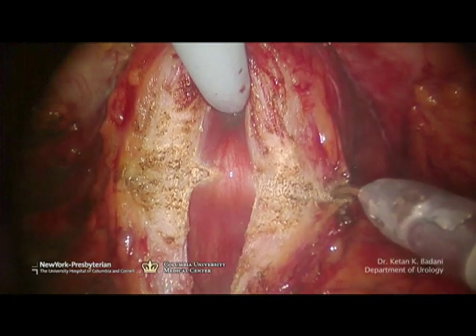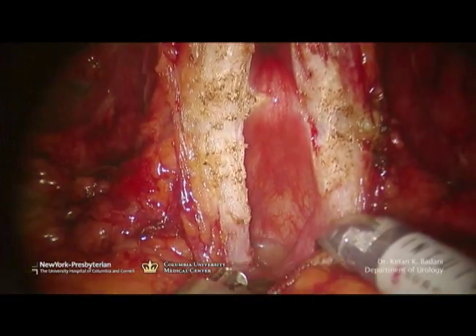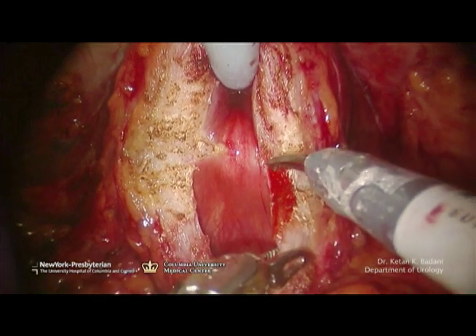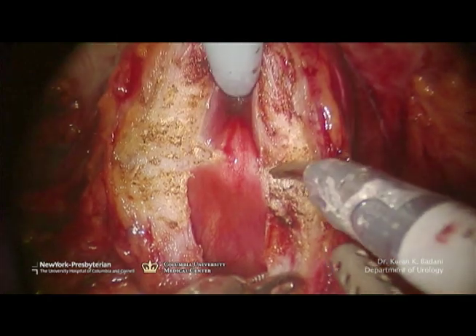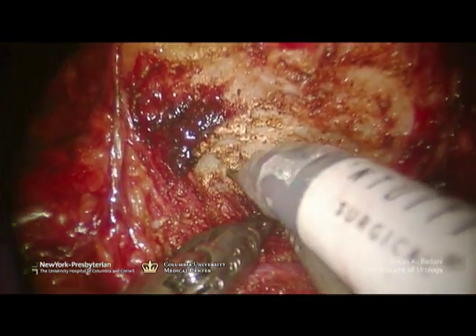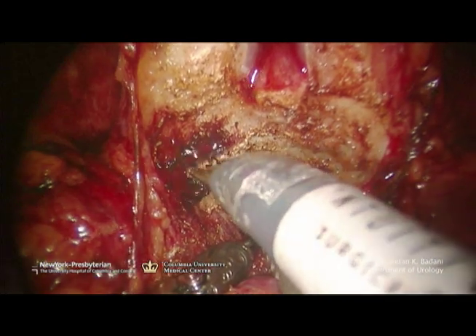Once I've done the lateral sides, I can adequately see inside the bladder and know exactly how wide I want to make it. I look in, identify the trigone, which is seen far below, so I know I have plenty of space to continue my bladder neck dissection. This gentleman does not have a median lobe or large lateral lobes, so no tailoring of the bladder neck will be necessary. The assistant is pulse-suctioning the smoke as it's created and giving me downward traction on the bladder to expose the plane I've created. You can just see the beginning of the vas deferens.